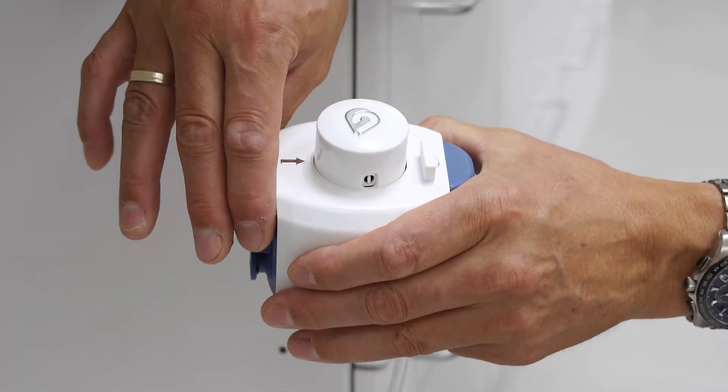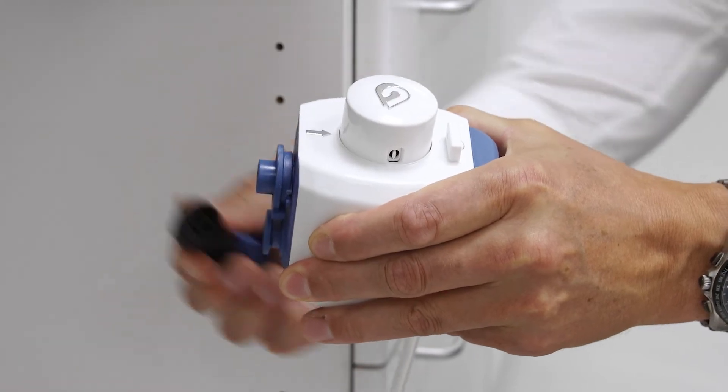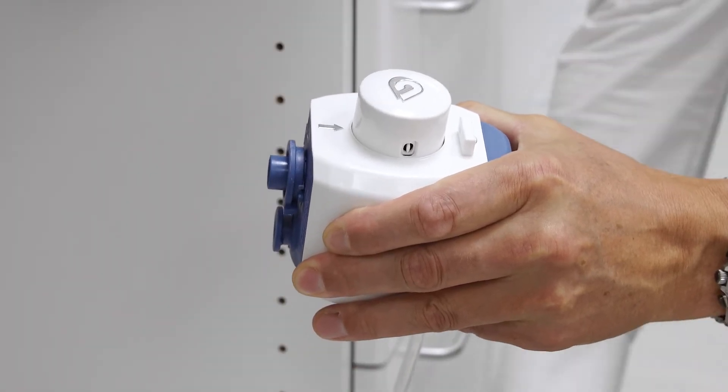Remove the blue clip by turning it 45 degrees and pull it away from the filter head. Replace the elbow with the access hose.